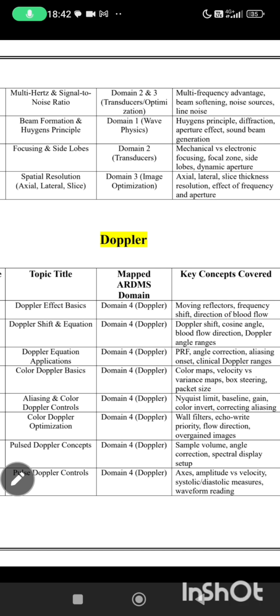And then you must know it's audible. The pulse and echo is not audible, it is ultrasound measured in megahertz, but the Doppler shift is audible. We can listen to the sound when we turn on pulse Doppler.